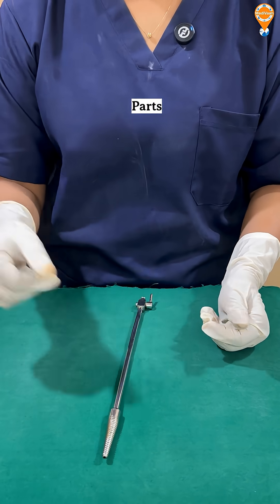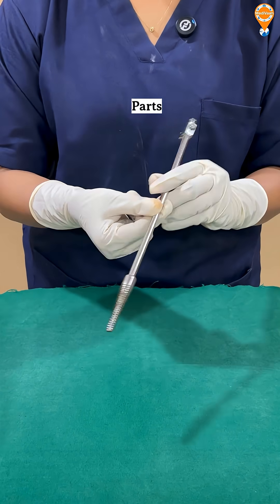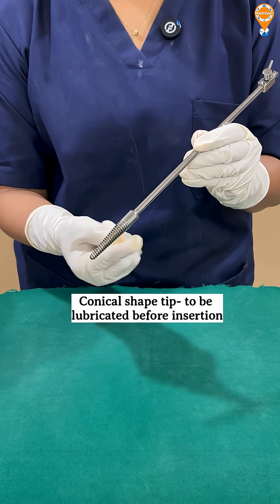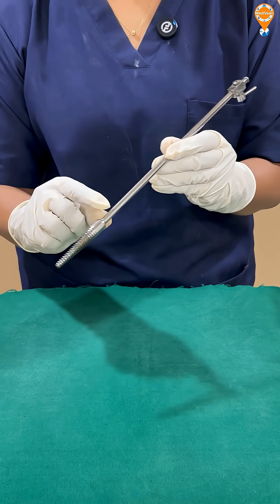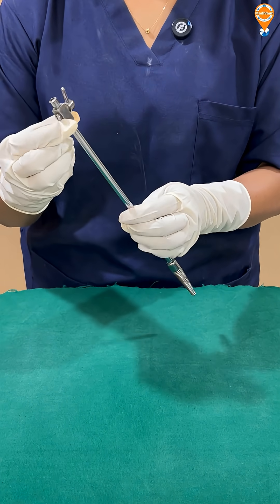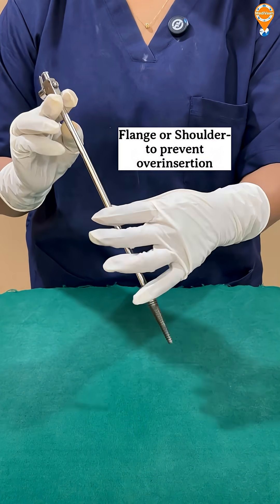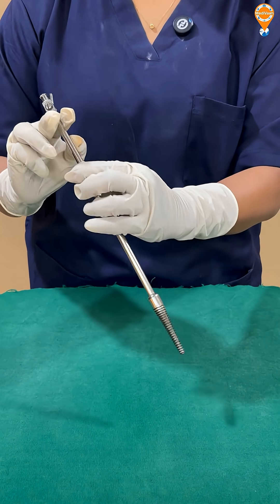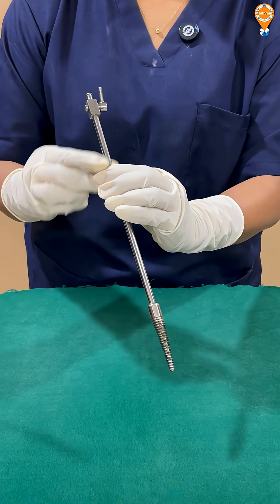Now, what are the parts of this Leach Wilkinson's cannula? We have got the conical or olive-shaped tip for easy insertion. This has to be lubricated while introducing. We have got a long handle, and this is a flange — a shoulder or flange — to prevent over-insertion. This marking indicates where to insert, not beyond this point.